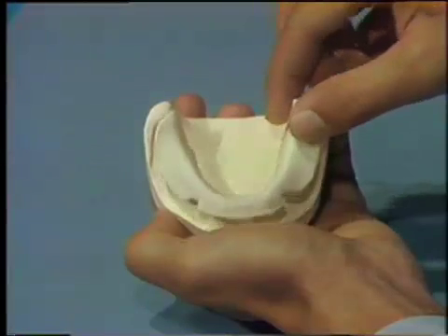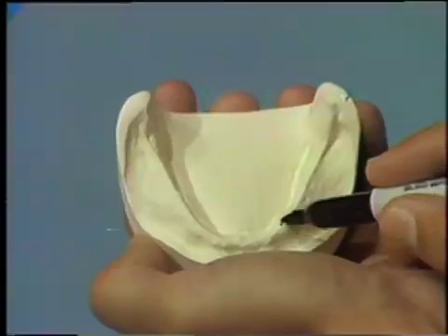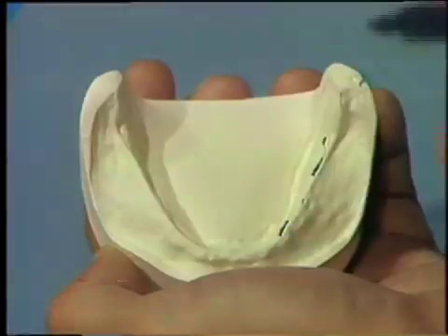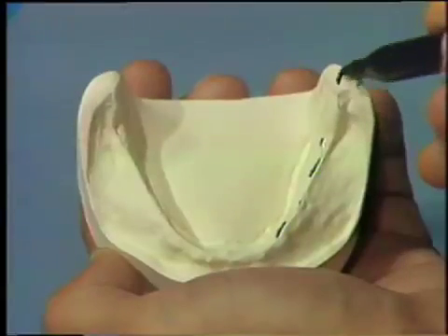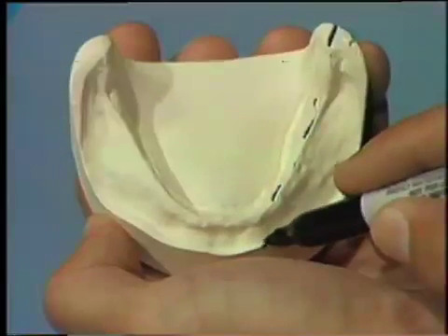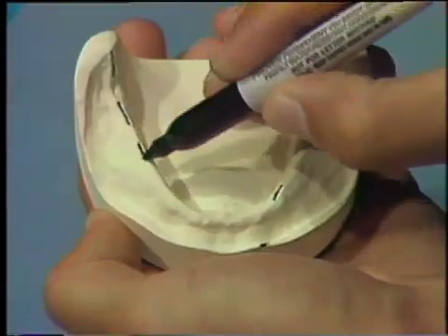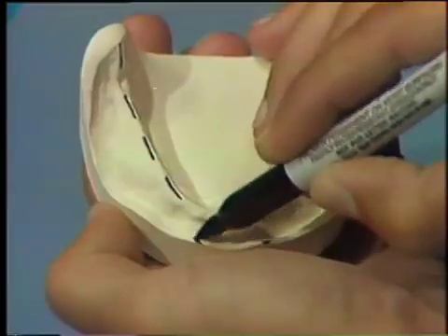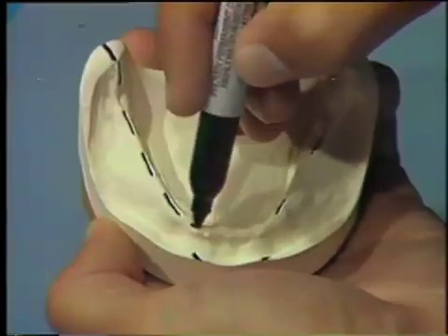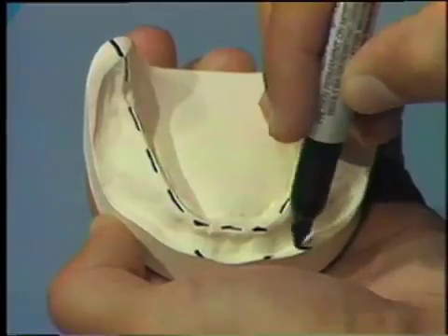To help in determining the position for the wax occlusal rim, draw a line on the diagnostic cast along the length of the mandibular residual ridge crest. Extend it onto the crest landing areas posterior to the top of the retromolar pad and anterior to the labial vestibule. Draw another line along the ridge crest in the anterior region, extending it onto the landing areas on both sides.